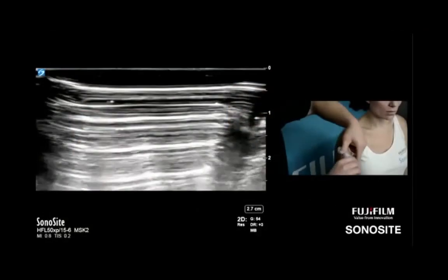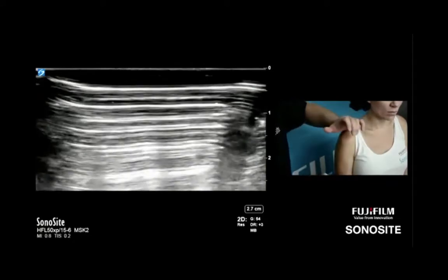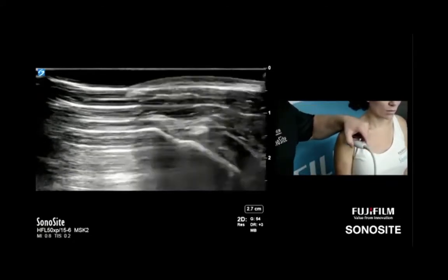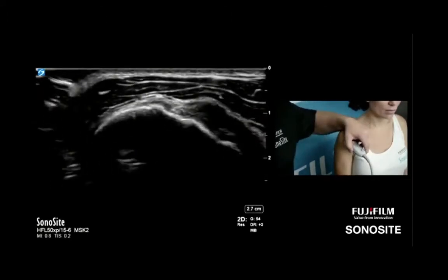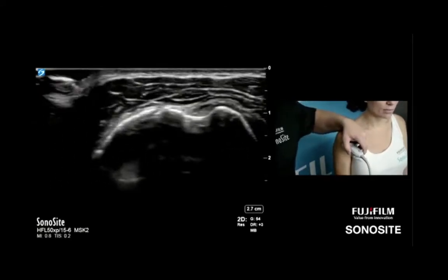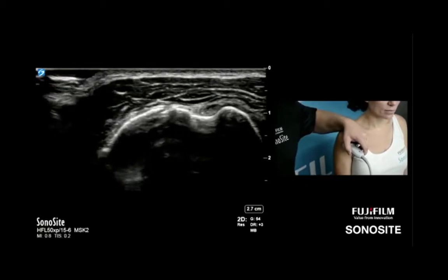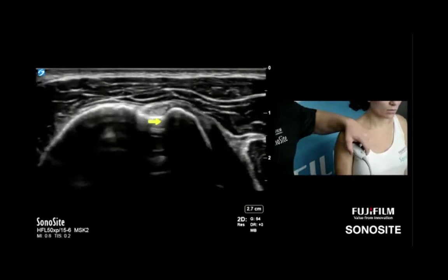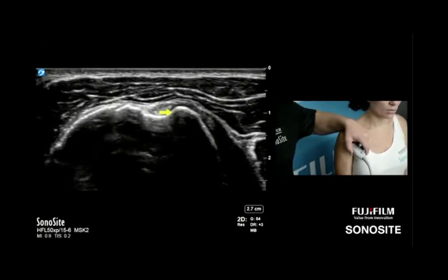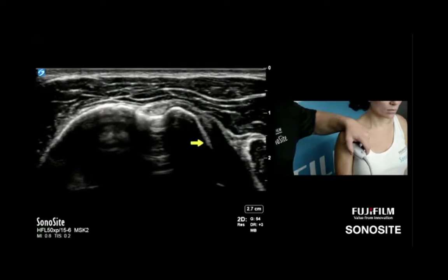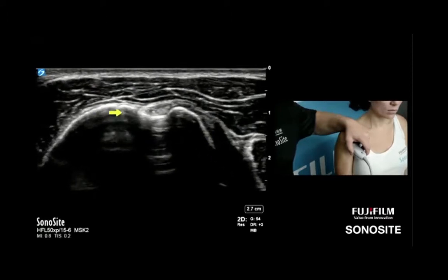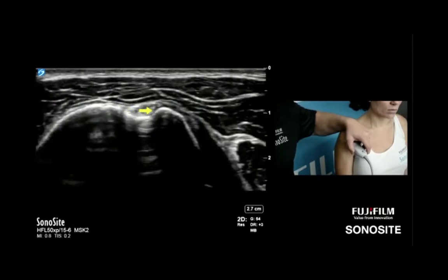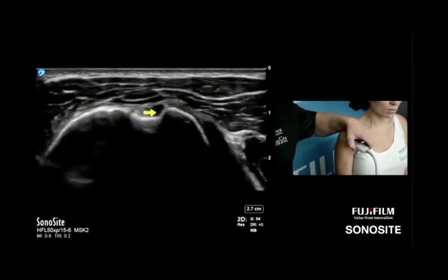Daniel: I like to start with my palm on top of the acromion when scanning in this plane. Just about everything in the rotator cuff can be seen about an inch from the acromion. We're looking for the bicipital groove — the hard bony cortical landmark. Medially, I want to see the lesser tuberosity; I can see the anisotropic subscapularis, and notice how rounded the greater tuberosity is. They're very different. If you don't see anything in the groove, check your angle and toggle the transducer for anisotropy.